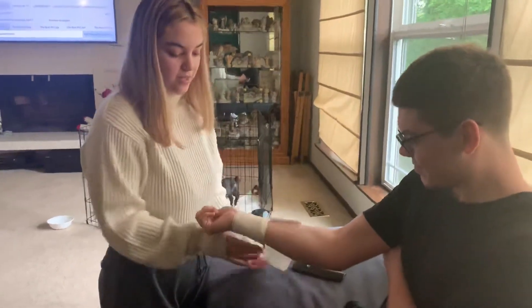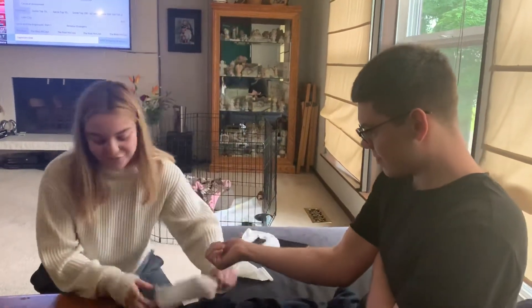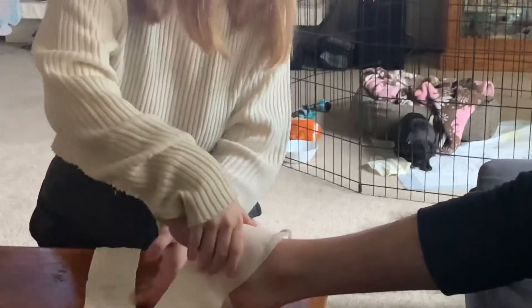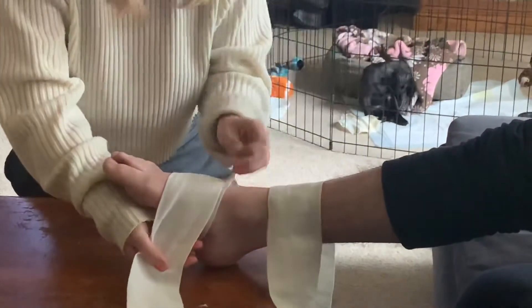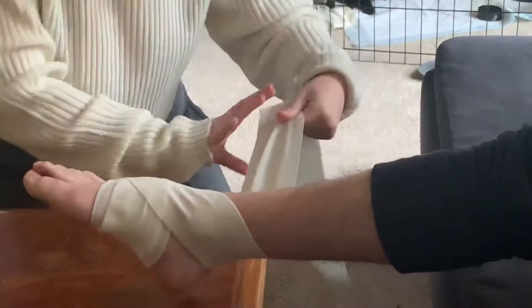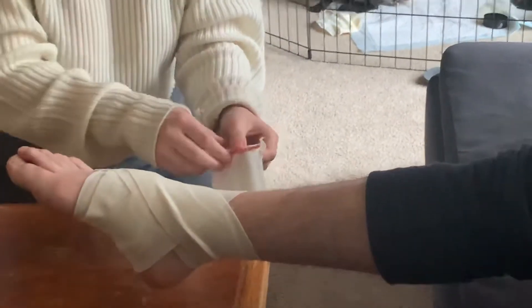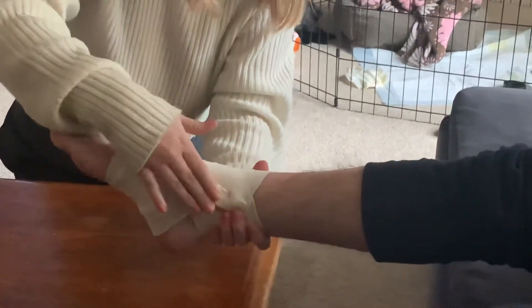For the last turn, it is the figure eight turn, and I'm going to do it on the foot. You first want to start with a circular turn and pull down the corner, and then I'm going to do the figure eight. This is going to hold any dressings down or immobilize an injured joint.